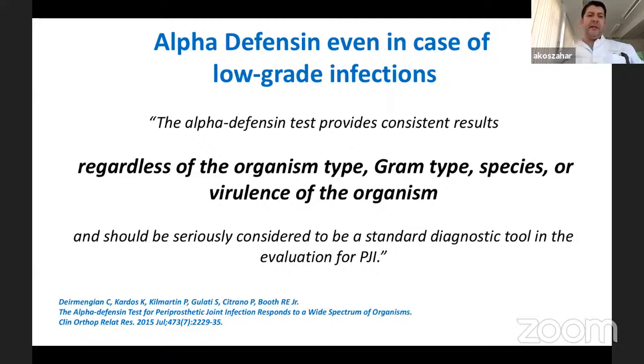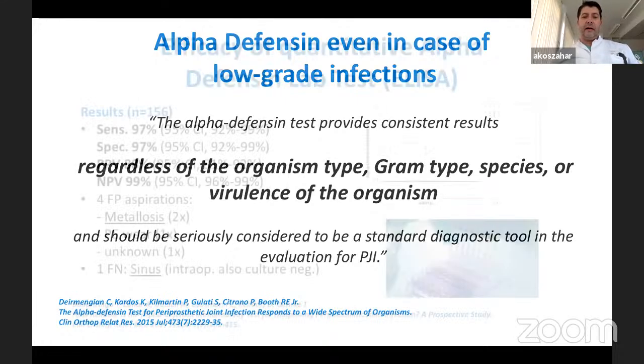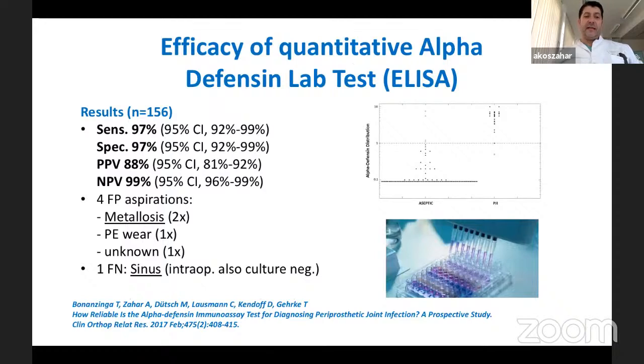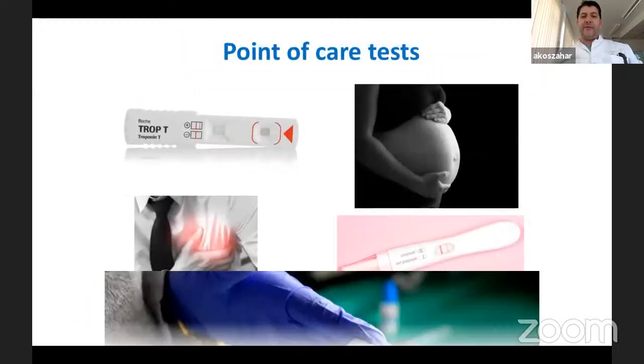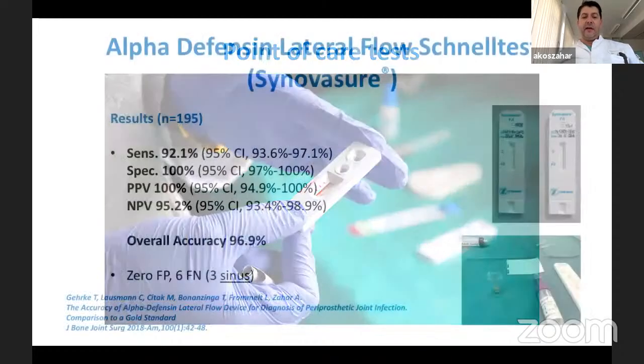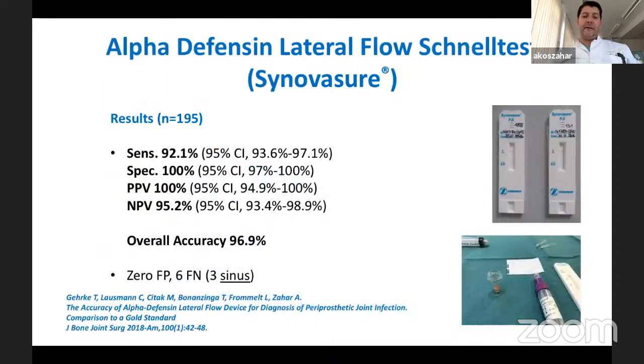Of course, if you have the possibility to use alpha-defensin, then it is a very, very strong tool, because regardless of the organism, regardless of the gram type, regardless of the virulence of the organism, you are able to show the infection with a sensitivity and specificity of 96% to 97%. If you have the possibility to use the ELISA test in the lab, it's even better. We have point of care tests for heart attack, for pregnancy, for HIV. Now we have also the bedside test for the alpha defensin. This is the Synovasure test.